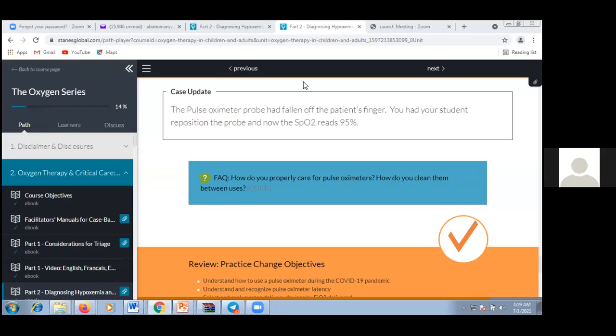Also, Semacho said cleaning with alcohol using clean gauze. That's good, correct. Disconnect from monitors, clean with an alcohol swab and wait for it to dry before using it. Let it dry by itself. Very good.